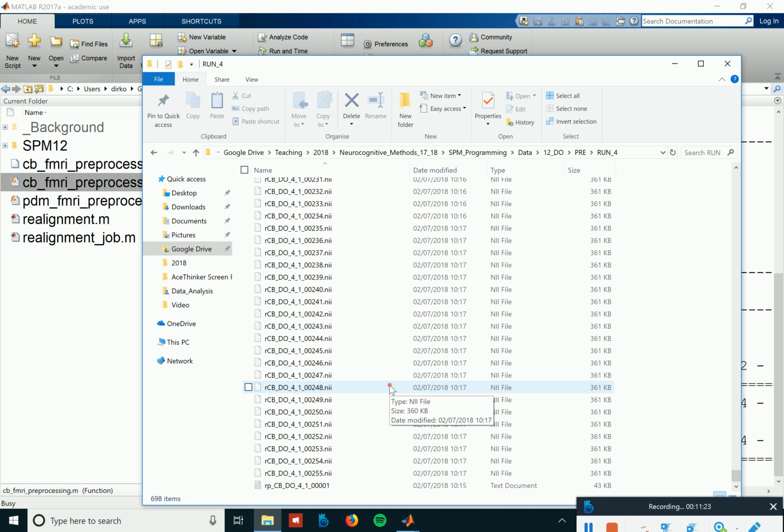So it's quite old school, I find, these days. It could be done in one file without these many files and so on. So there is room for improvement of SPM, not only in terms of the mathematical algorithms, but also in terms of how the data is organized and stored. Because writing to disk that many times is really not that efficient, and I would assume that in the age of big data there exist much more efficient ways to handle this.